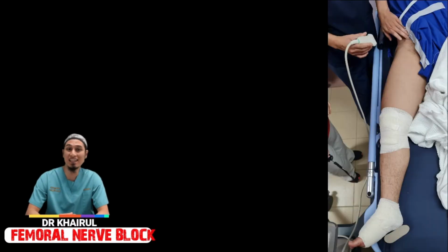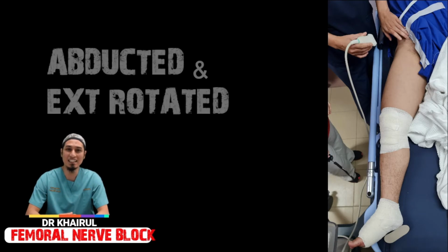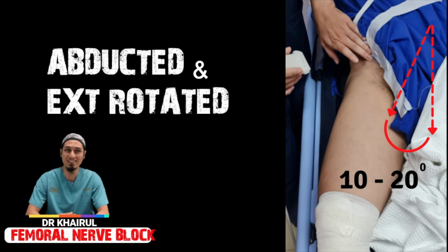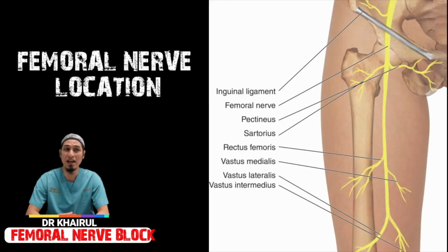Patient lies in the supine position. The ipsilateral lower limb is abducted 10 to 20 degrees and slightly externally rotated with the lateral side of the foot resting on the table. The aim is to block this nerve at its most accessible proximal location and optimize block distribution.